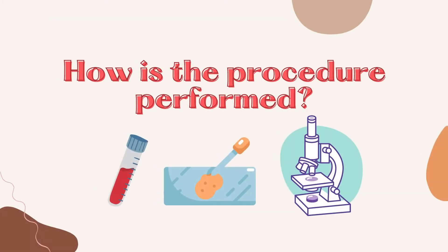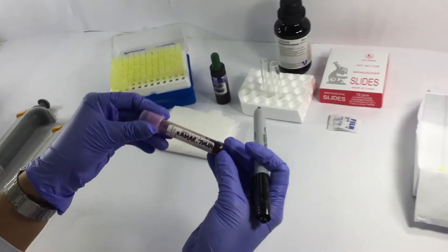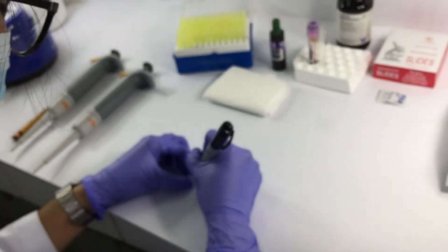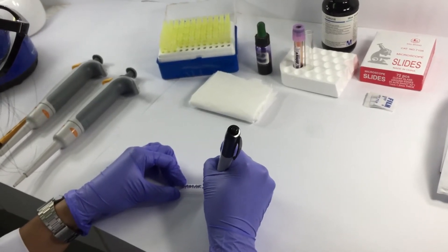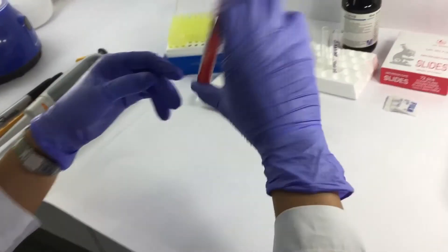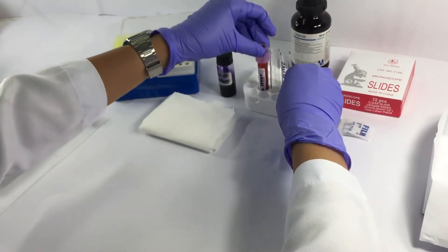Here are the steps on how to make your smear for your reticulocyte count. First, get a clean test tube and label it with the patient's name. After labeling the tube, get the patient's sample and invert it several times to redistribute the cells that have settled at the bottom of the tube.